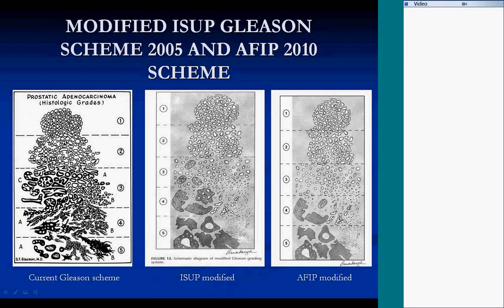In the previous Gleason schemes, and now you can see with this most recent scheme, and almost all urologic pathologists would endorse this, that there are single separate glands in pattern 3, whereas now pattern 4 is cribriform adenocarcinoma, as well as fused glands, gland fusion, as well as poorly formed glands, and pattern 5 is sheets of carcinoma cells, single cells, as well as comedonecrosis, comedocarcinoma. So those are some big changes, and actually the single cells aren't that well represented in the old pattern also.